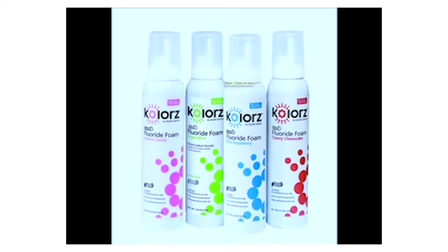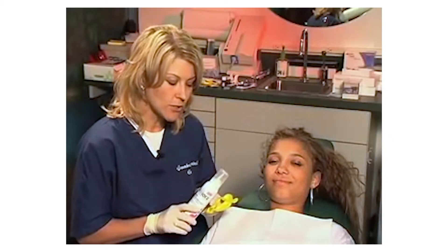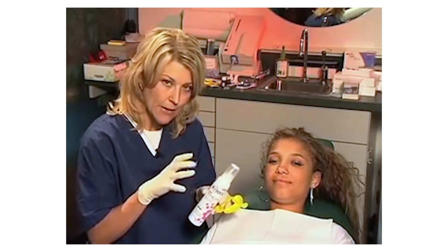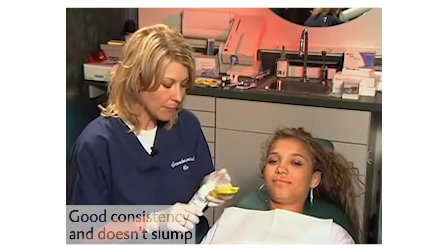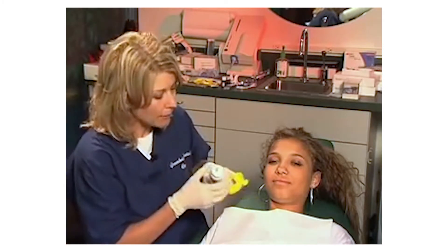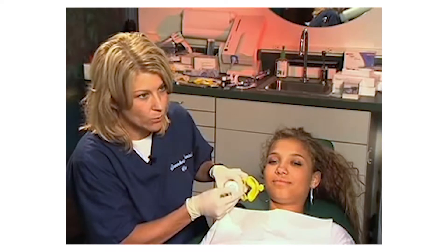This is cotton candy flavor. It's about 60 seconds. One of the things we've noticed with the Colors fluoride system is that you just need a little bit — it really foams up. You're not really shaking it; it's not watery and it doesn't slump. I want to demonstrate that for you. We're going to pop the top, and when we do that you'll notice it's got a little plastic piece here — you'll want to pop that open.